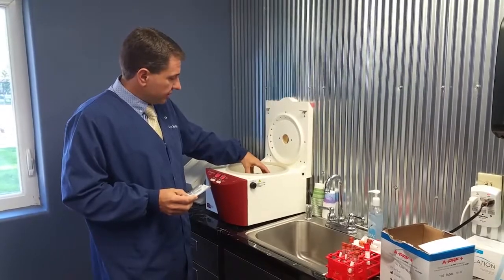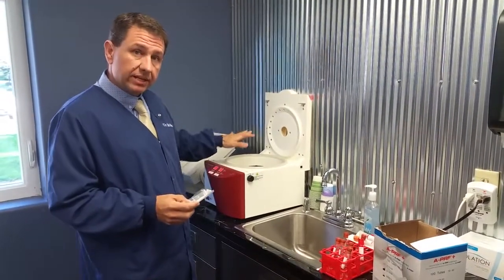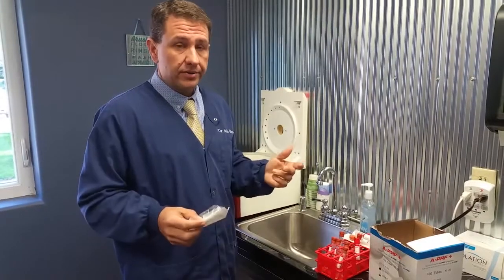One of the last things to know is that when you collect your material, immediately get it into the machine. If you don't get it into the machine immediately, you will get a very, very, very small plug. Those are my tips for today.